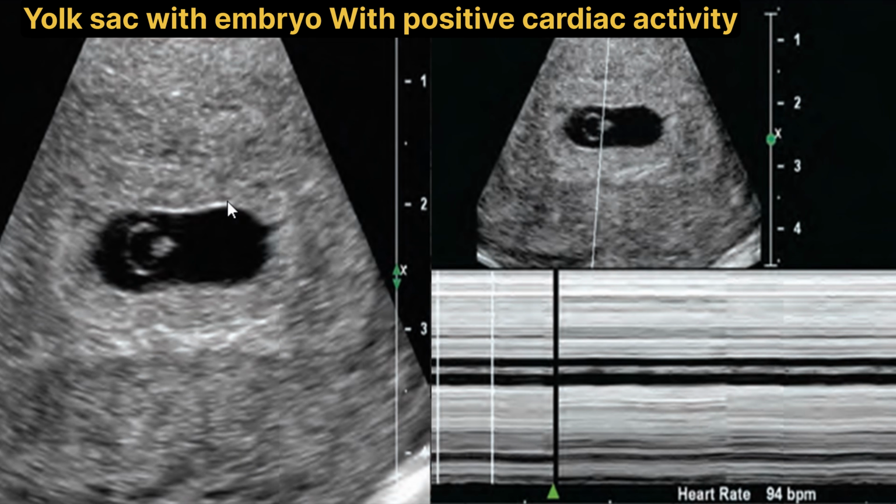This is a transvaginal image of the intrauterine gestational sac. It shows a small echogenic focus along with the abutting yolk sac, corresponding to a 2 mm measurement of its CRL. This is the expected location of the embryo within the uterus, which is identified along the edge of the yolk sac when first visualized. Now here we can see the embryo with positive cardiac activity.